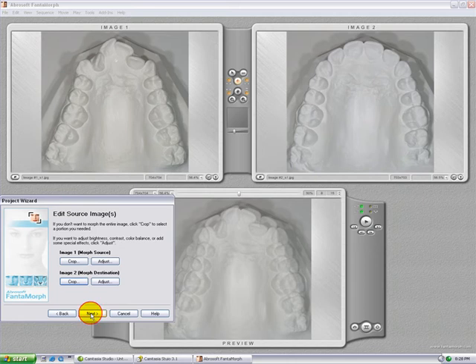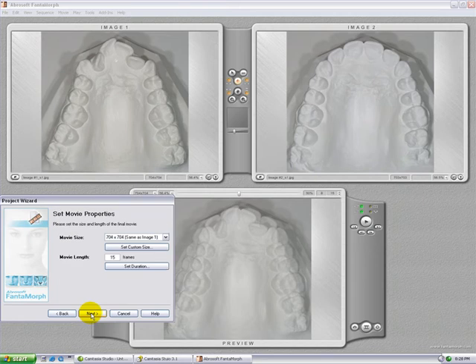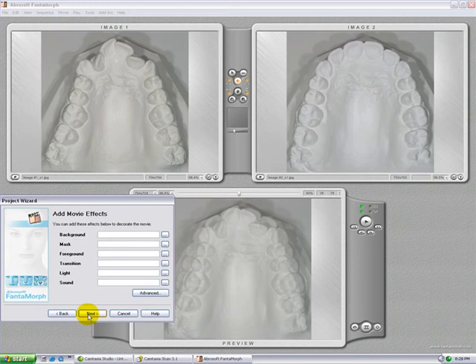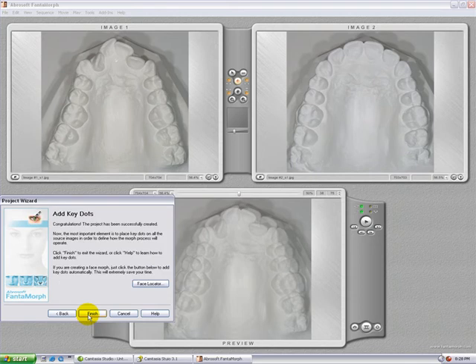Click on next. Adjust the movie length to 70 frames. Click next. In this case, we'll skip add movie effects, and we'll skip the face locator.